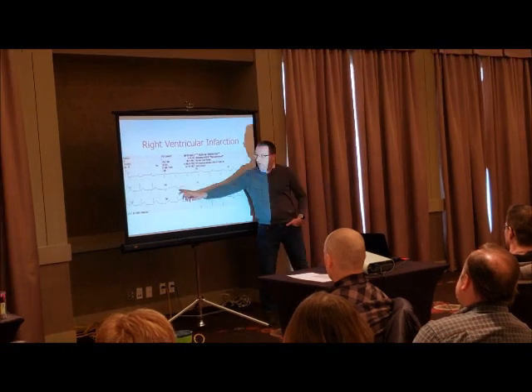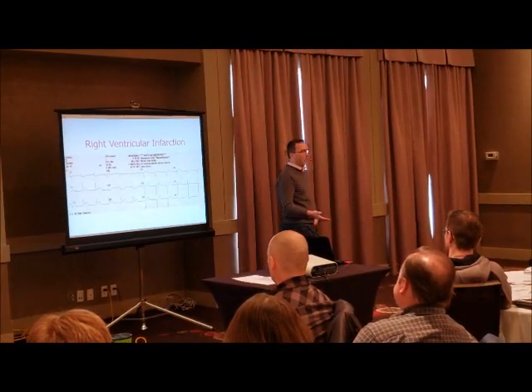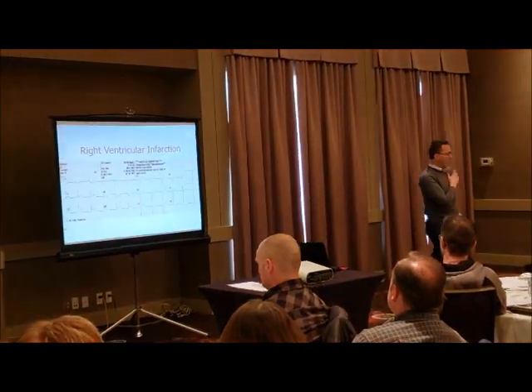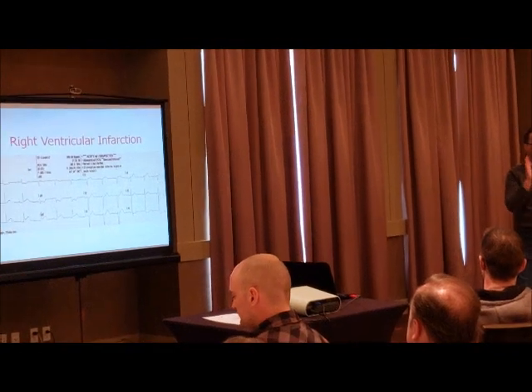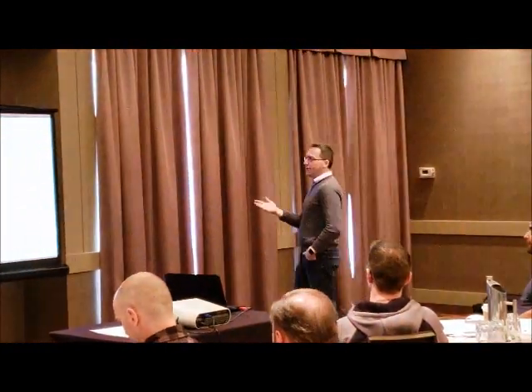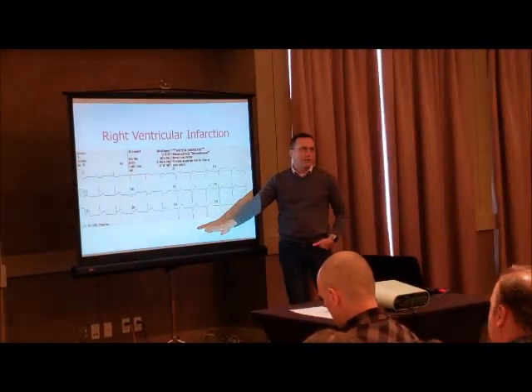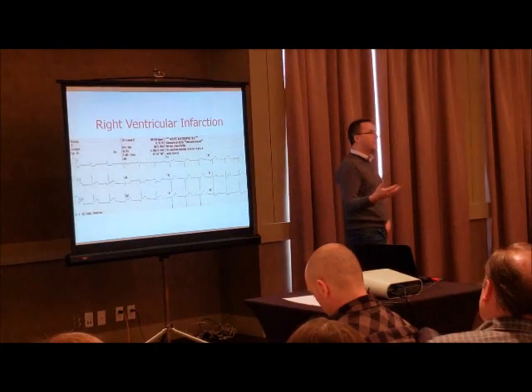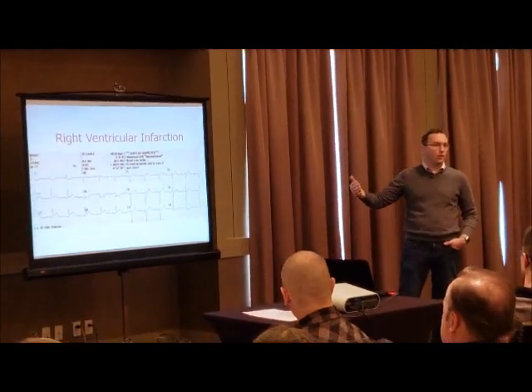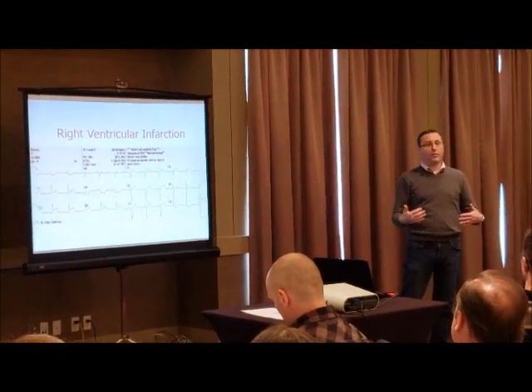Let's go to our magical rule in lead aVL. Do we have a reciprocal change? We do, okay? You know, in our system, that's like dispatch medic 3, code STEMI, at that time to get our timestamp, okay? Now, in this case, you'll notice we don't have reciprocal changes in the right precordial leads, so we're not seeing signs in this particular case of posterior extension of this acute inferior STEMI. It's not always there. It's very frequently there, but it's not there in this case.